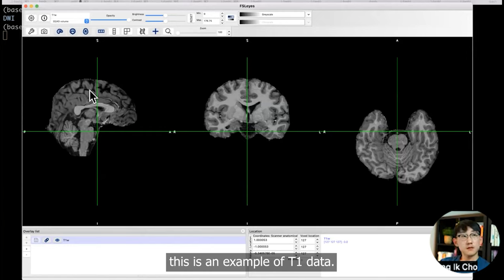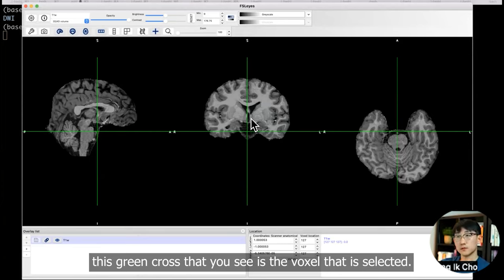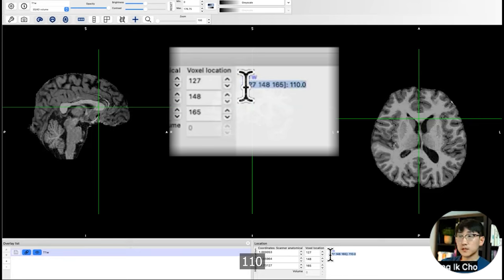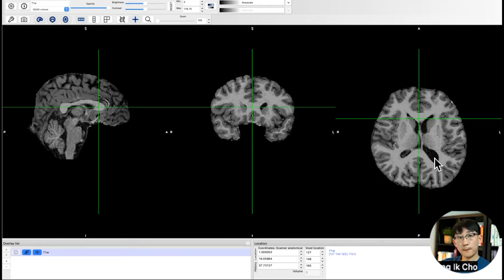Here it is. This is an example of T1 data. The green crosshair that you see is the voxel that is selected. I'm going to select corpus callosum here, and you'll be able to see a value here: 110. So that's 110. Let's go to a CSF area. Here is 18.